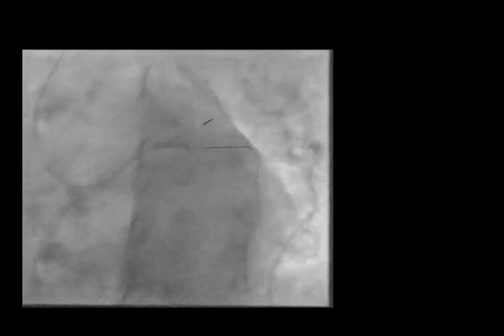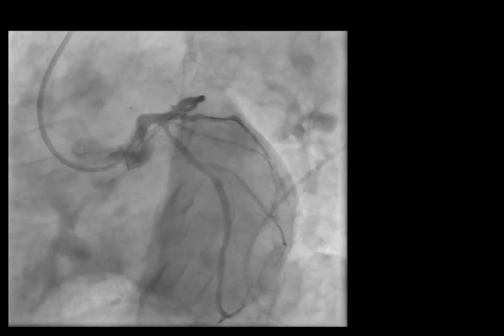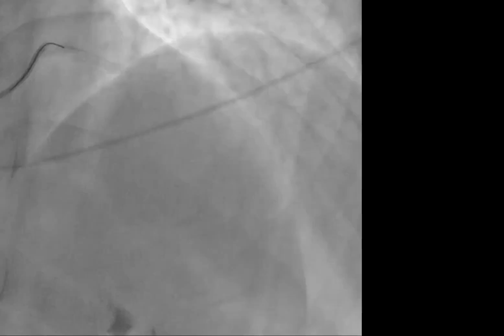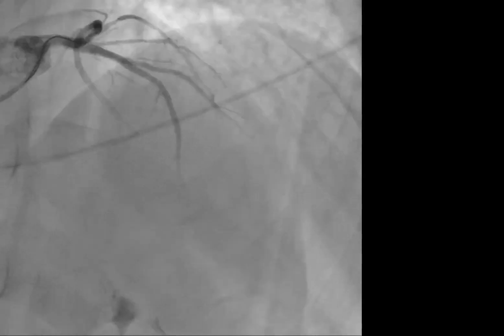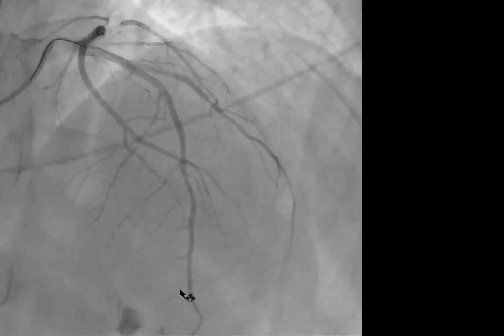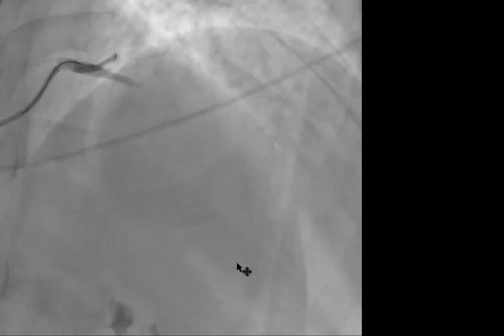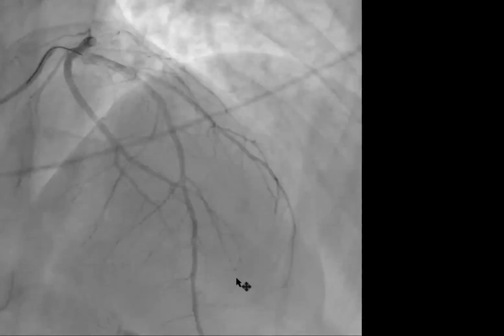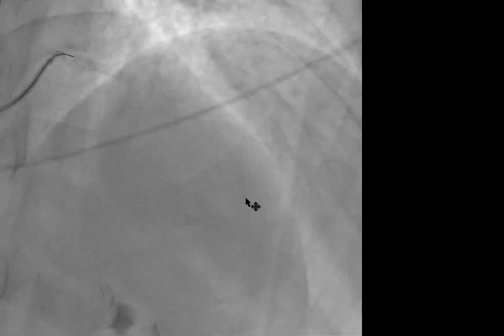After that, we did a 2.75 and a 2.5 balloon kissing balloon inflation. This is the final result. The flow is still a little bit slow, probably because of the infarct, but it's much better now. Thank you.